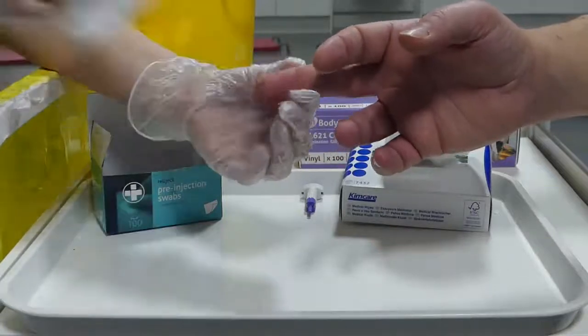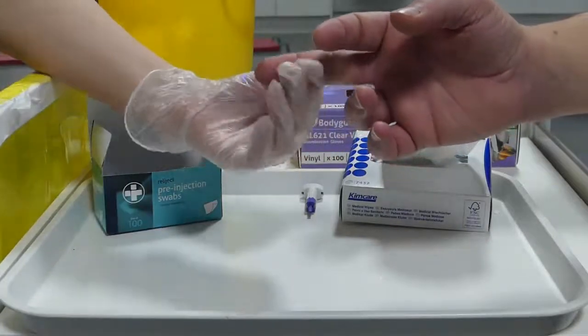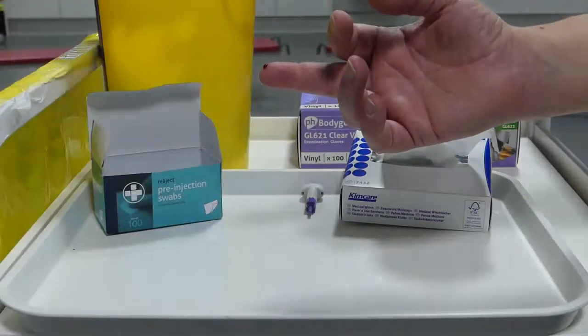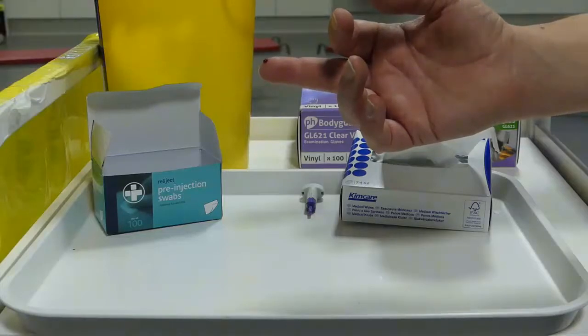Next wipe the first blob of blood away which is important as it could be contaminated with alcohol from the wipe. Then gently squeeze and release the finger to milk and get a good blob of blood ready for sampling. Please notice that the sample site is at the fingertip. We don't use the fleshy pad nor too close to the nail as blood will trickle down the nail.